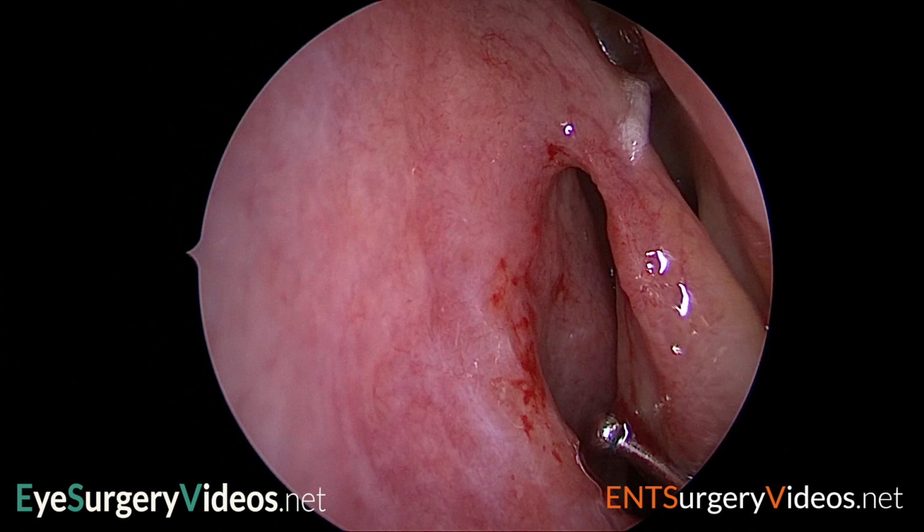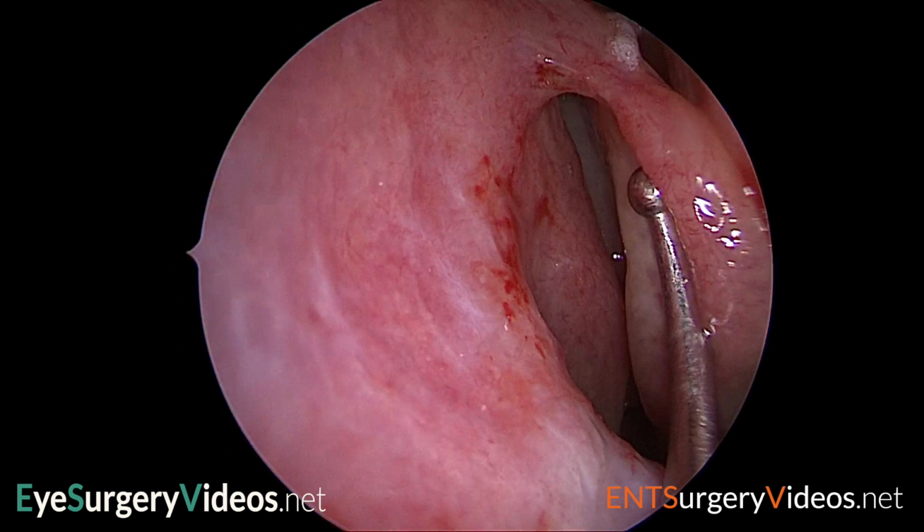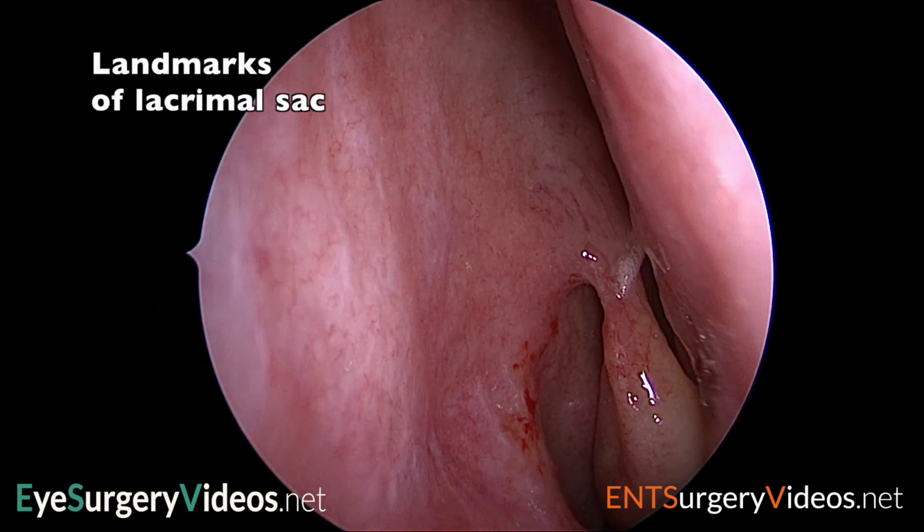Endo-DCR surgery is almost invariably conducted with an anterior approach, which does not require formal uncinectomy. However, the root of the uncinate is frequently detached to allow exposure of the superior lacrimal sac. Just behind the uncinate, the bulla ethmoidalis can often be seen projecting further medial than the uncinate.